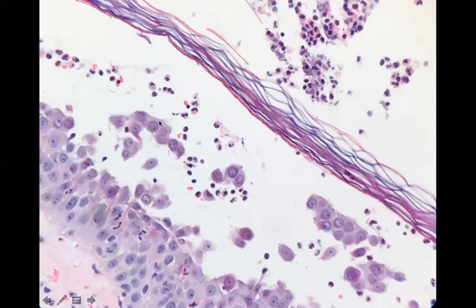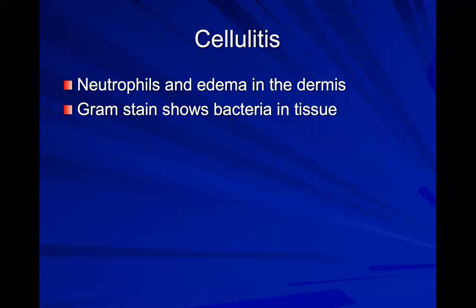One of the ways that I distinguish them is that they tend to retain their round shape in their acantholysis, and it's down in the spinous layer as well as in the granular layer, whereas pemphigus foliaceus tends to split only in the flattened granular layer. You don't see these round acantholytic cells in the pustular space. But that's not a hard difference. That's just kind of a clue that helps me distinguish them. But this is a bullous impetigo.